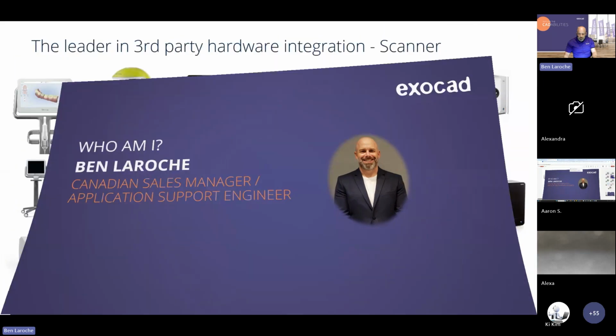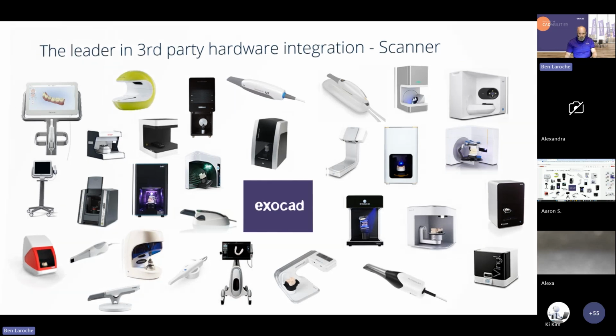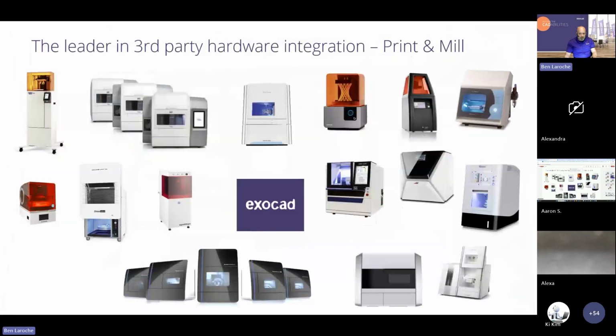In exocad, as I said, we work with pretty much anybody that's willing to work with us. All these scanners are fully integrated with us, as well as on the back end, all the printers and mills. I apologize for the raspiness. My throat's not doing too well today.